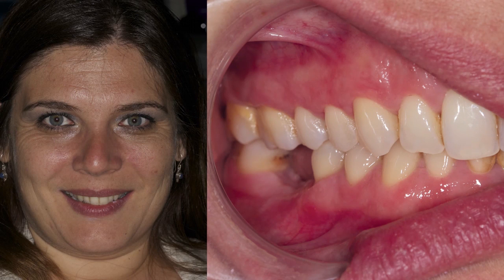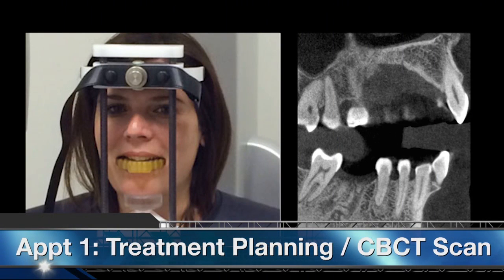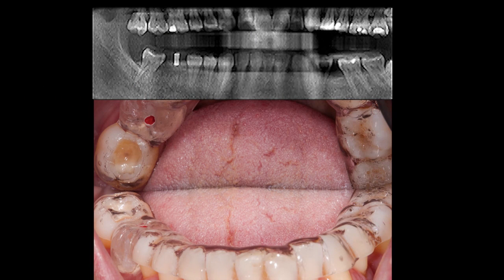After periodontal treatment, to replace the missing tooth, I planned a single-stage surgical protocol for the implant procedure. On Nora's case, I used the Inclusive Tapered Implant, a screw-retained Bruxer Anterior crown to replace number 30, and an Astron bite splint to help protect patient dentition from parafunctional habits. I chose Bruxer Anterior for the implant crown because this material has an average flexural strength of 650 MPa. Prior to implant placement, I used Cone Beam CT to acquire three-dimensional images to evaluate the prospective implant site. A 2mm thick radiographic stent with a 3mm drill opening for gutta percha helped me gather information about the location of anatomical structures in relation to the planned implant site.